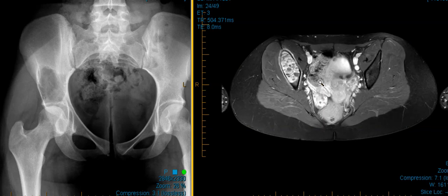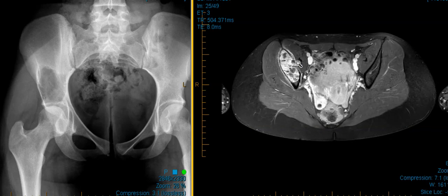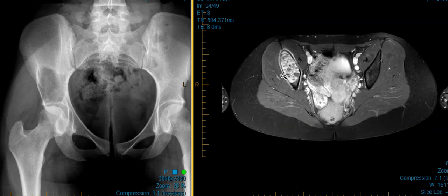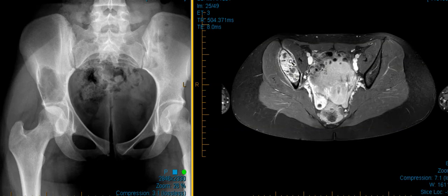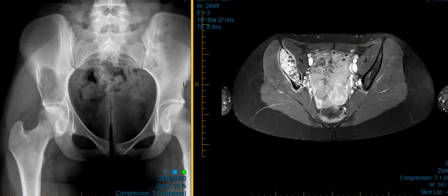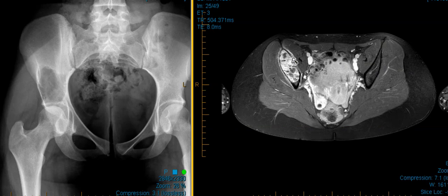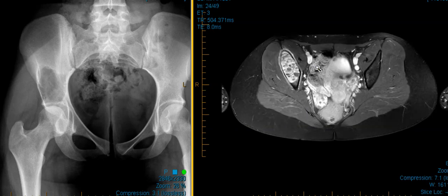This is a view with enhancement. All this that's bright is enhancement of the areas between the cysts, and the areas that are dark are the fluid pockets. So this is an expansile lesion with multiple fluid components, and this is classic for an aneurysmal bone cyst, which luckily is a benign lesion.